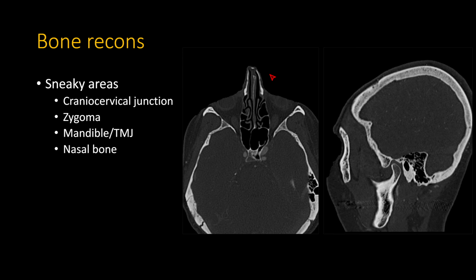Misses can be very valuable in that, every time you miss something, just make sure to add it to your search pattern. And you're going to have a pretty good search pattern. And when you're actually independent and on call, you're not going to make those same misses.